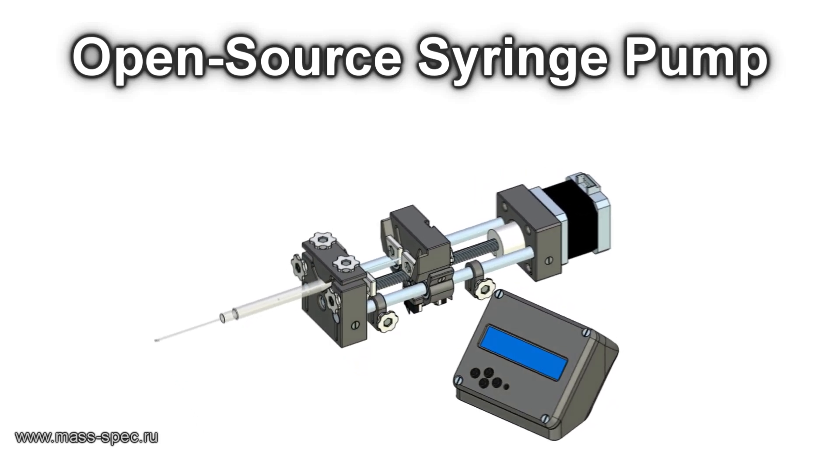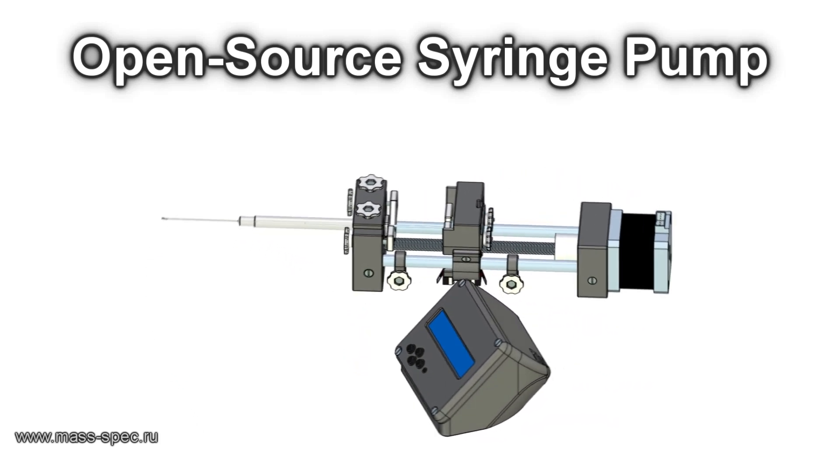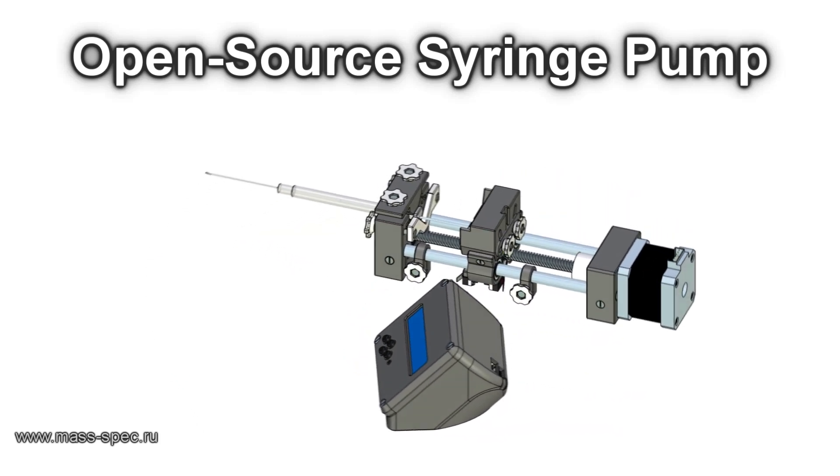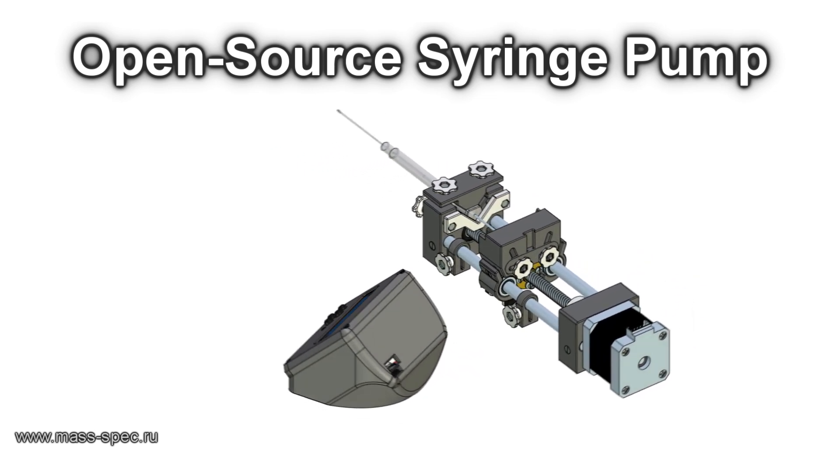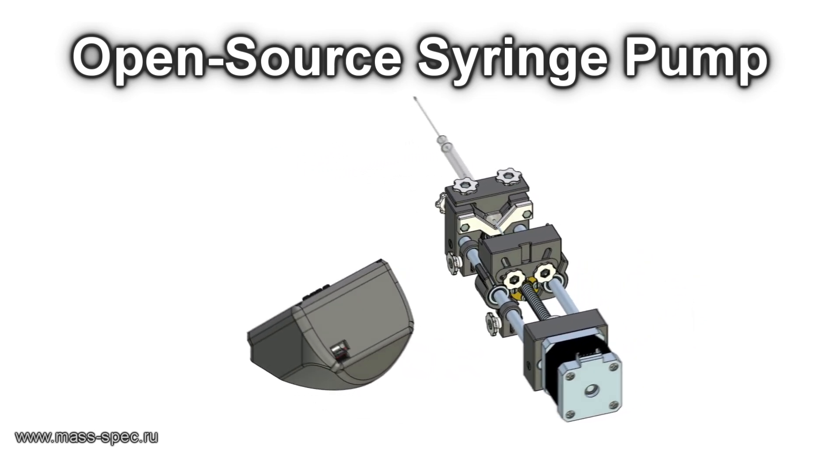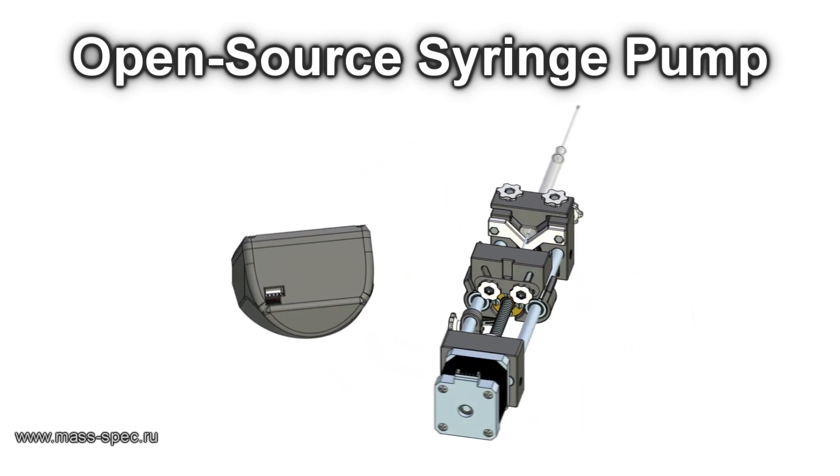This is a demonstration of an open-source syringe pump designed for use in an analytical laboratory. This is an open-source project which can be easily replicated.